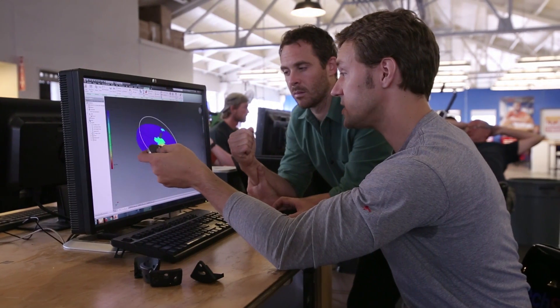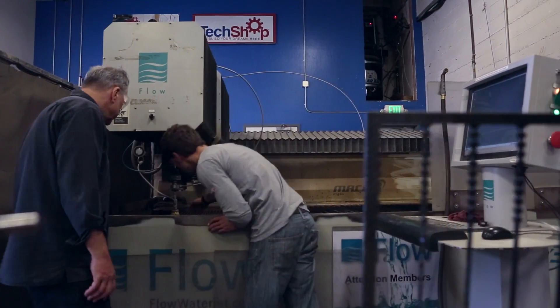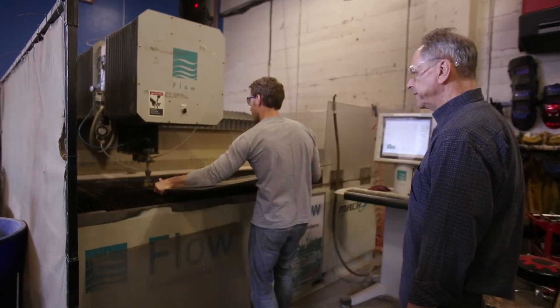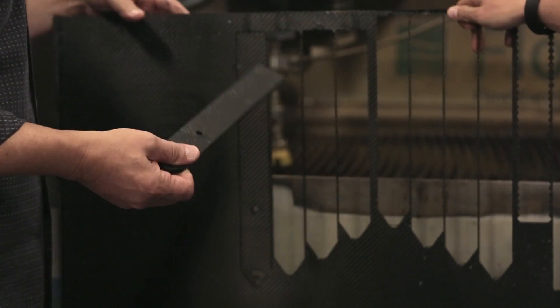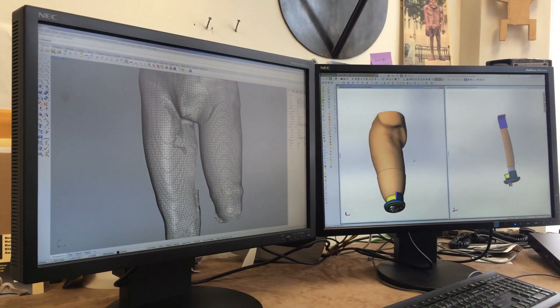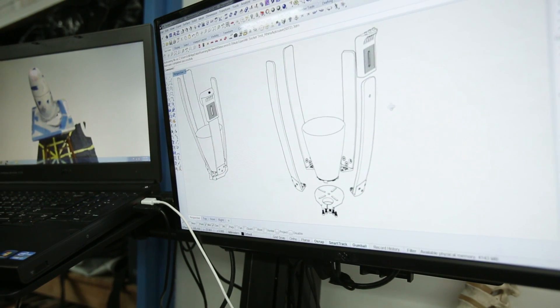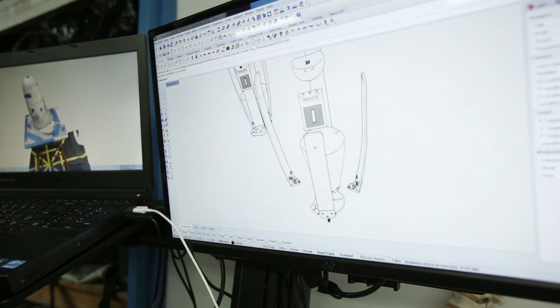The main frame is based on a thermoplastic carbon fiber, selected for the performance that those materials bring. The carbon fiber struts come as enlarged sheets and we water cut them to specific sizes. From a digital file of a residual limb, we capture certain portions of that surface, create a digital representation, and mold the carbon fiber to that representation.